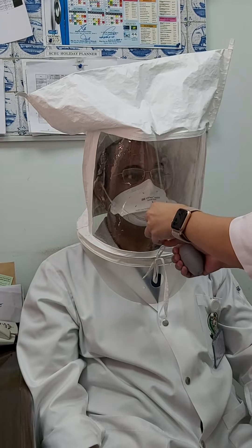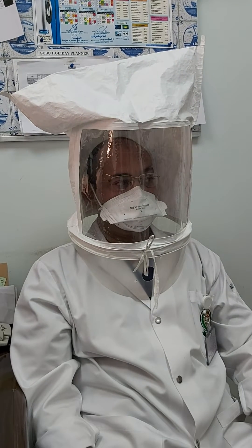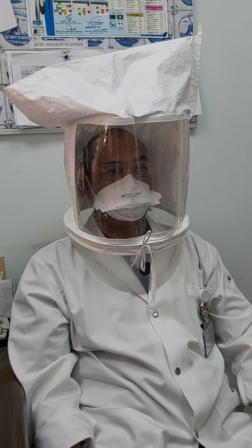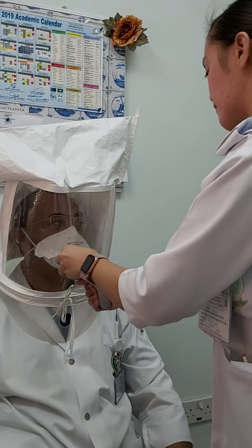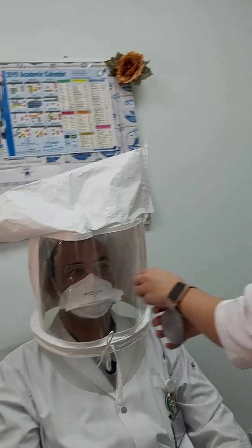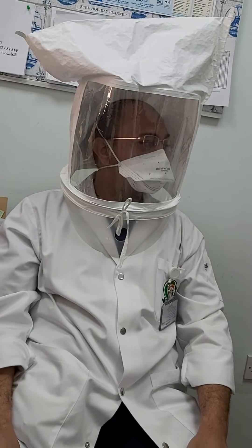Next, big breath. Next, your head moves side to side. Continue. Next, up and down.